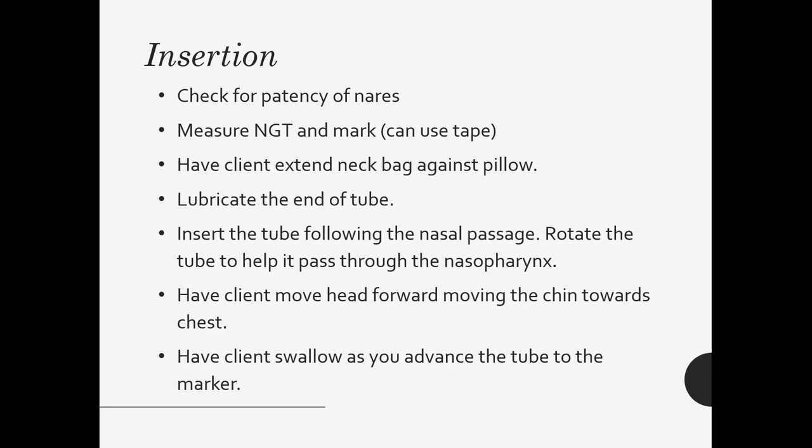So what this does is, like we talked about earlier, it's going to close off that airway, okay? So our epiglottis is going to close off over our airway when we swallow. So that way we know the tube is going to go down into the stomach.